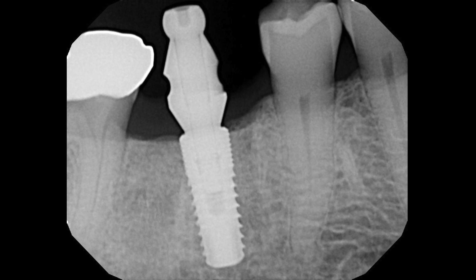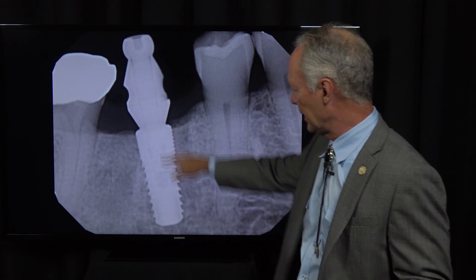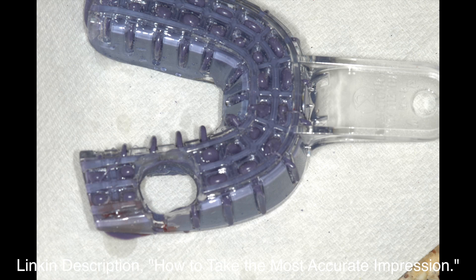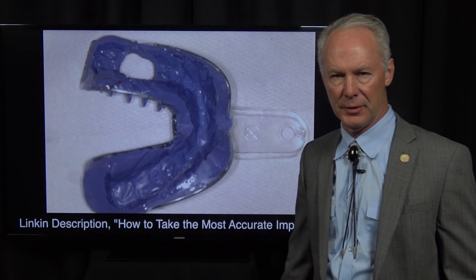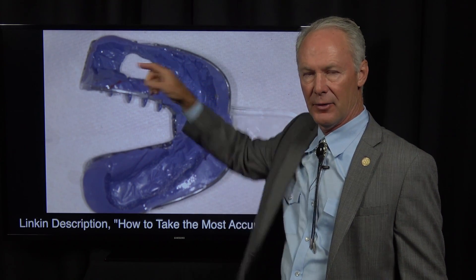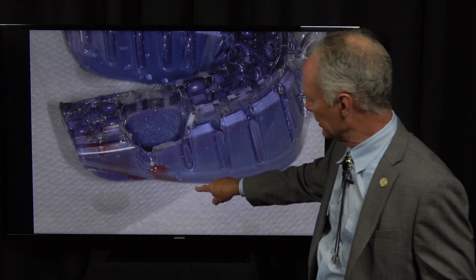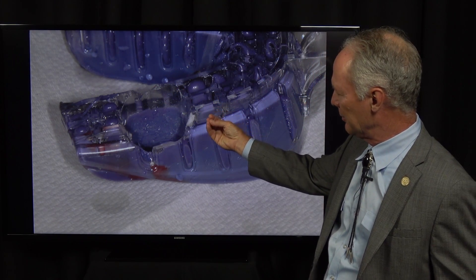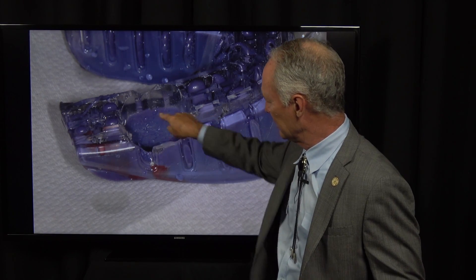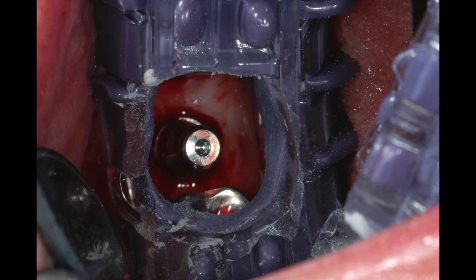Take a radiograph to confirm that the impression coping is completely seated, and you can see the implant is ideal. This is going to be a polyether with custom tray, open tray impression. An open tray impression means you've got a hole in the impression tray, and the impression coping will be sticking out of that hole so you can unscrew it and pull that impression coping in your impression. It's important that you're able to wipe impression material off the coronal part of the impression coping so that you can see it right there.